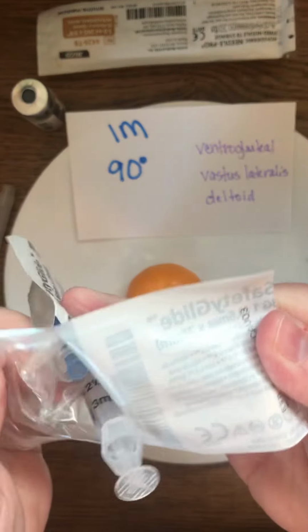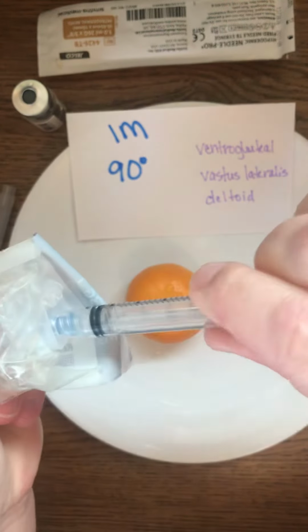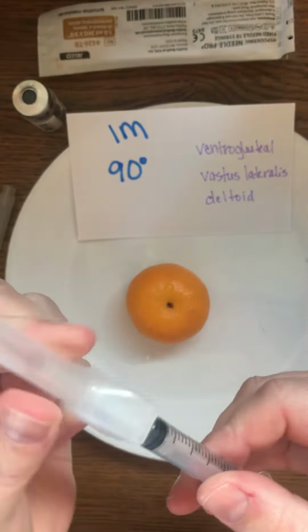So again, remember these are sterile, so we don't want to touch any of this. So I'm just going to grab the syringe part and hook it up right away into that needle part. Push on and twist, and then you can take it out. So just to give you an idea here, you can see the length of that needle. And I'll grab out my subcutaneous one that we just used, just so you can see the difference. Right. So definitely a difference, so you can see it's going to get into that muscle layer.